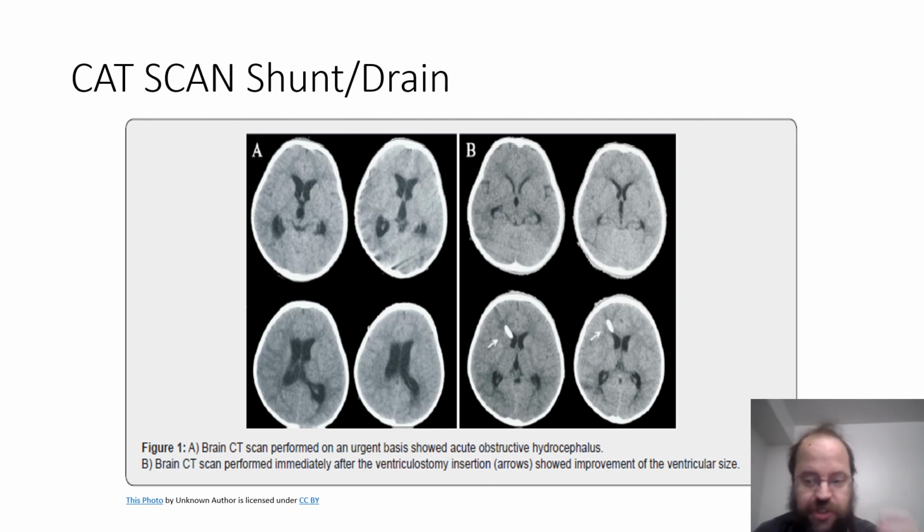The problem is the MRI is slower, and we'll be getting into why later on. But just understand that the CT scanner is the best at seeing things quickly in an emergency situation, but it won't tell you everything. And what it does tell you can sometimes leave you asking, what am I looking at here? If I need to cut, a CT scan is great and at least points you in the right direction.